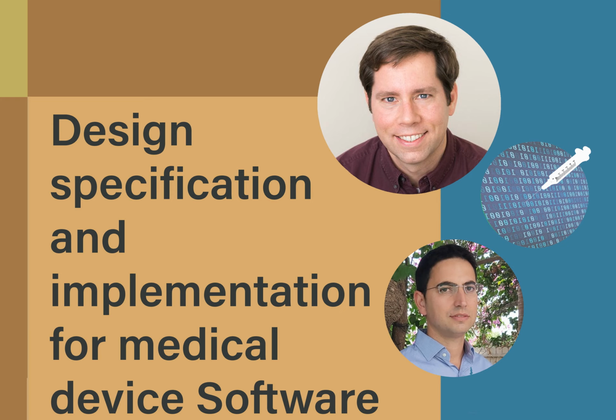In my work, I typically use the one from the BARR Group. That's a well-known embedded software coding standard. Static analysis, yes, I would say, especially in the work that I do, where it's embedded C, I find static analysis to be quite useful. I've seen it in other domains, like if you're doing some complicated user interface, it may be a little more difficult to get static analysis tools to give you good, valid results without a lot of false positives.